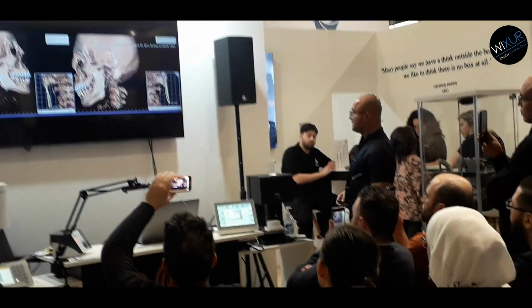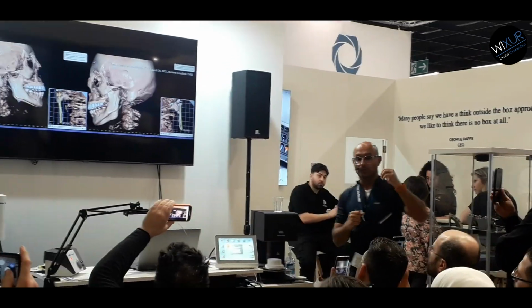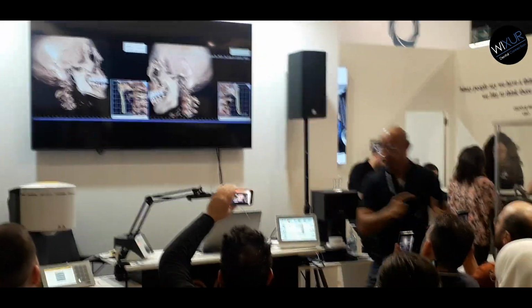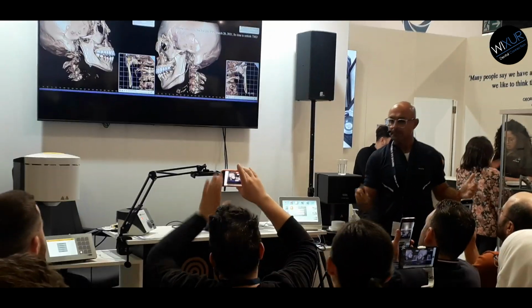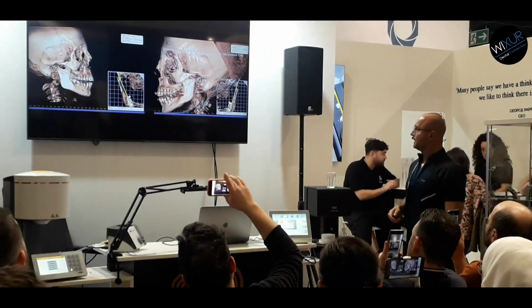Right side 63 millimeters, left side 58. So very short. So we have flattening, short ramus. It means the lower jaw moves a lot. That's why the occlusion of the left side is damaged. So now we know the cause, and now we have to solve it.